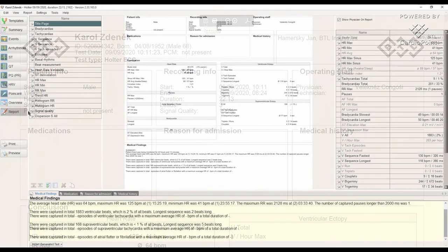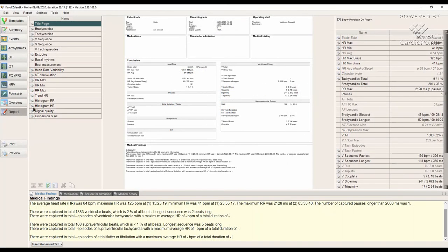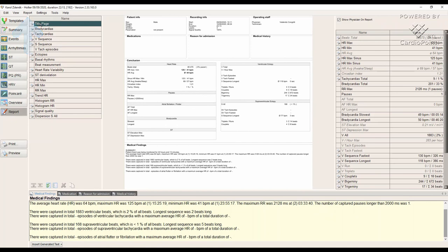In order to use the same report settings in the future, we can save our report profile via the report context menu. This function will save us a lot of time during further examinations.